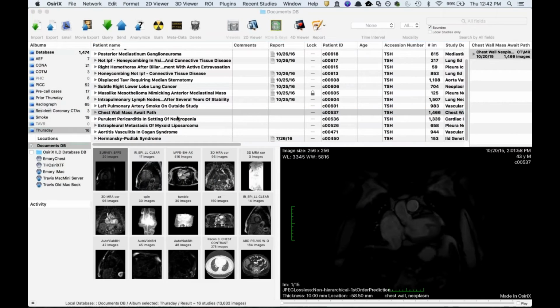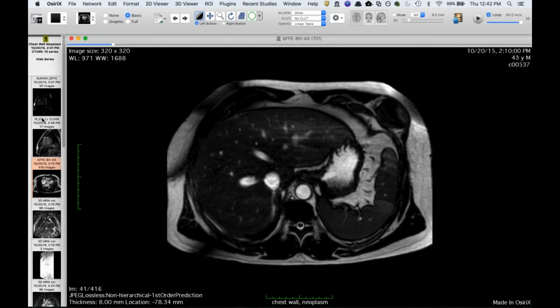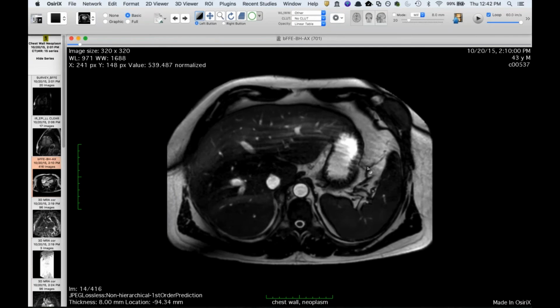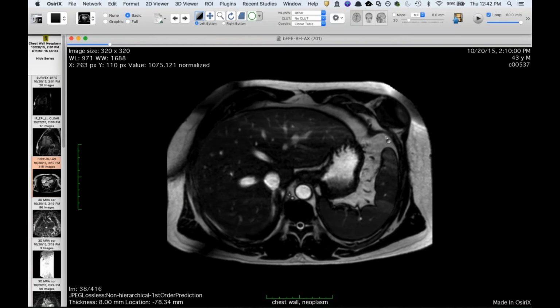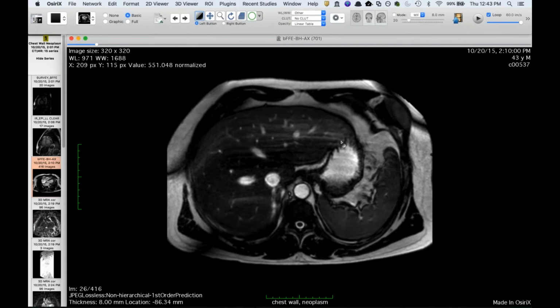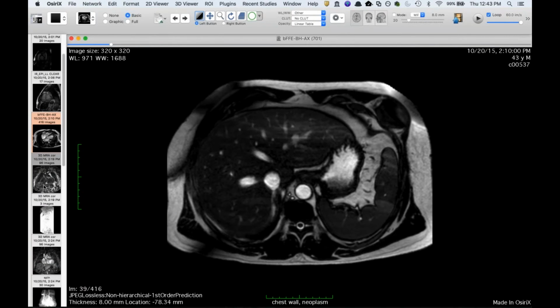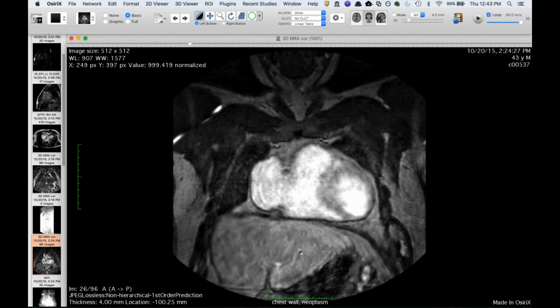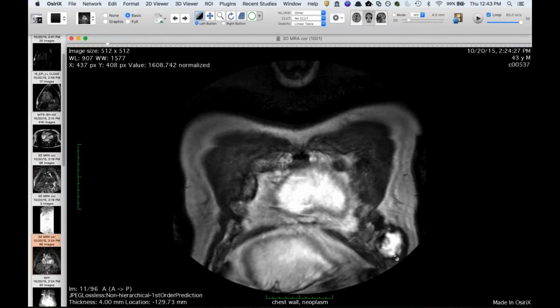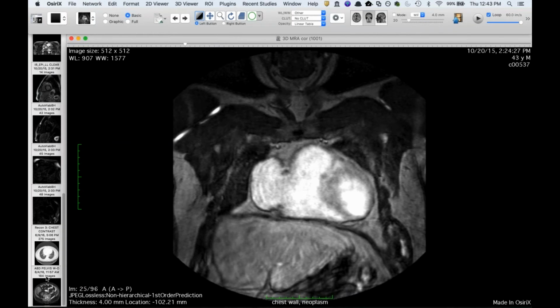This one, I was just looking up the path. I don't have the report, but I can tell you what it was. I showed this one a few weeks ago, and this was an incidental finding. This was an MRI done for left atrial mapping for AFib ablation, and there was this mass that was overlooked at the time on this study. This was back from last October, and you can see it's deep to the pectoralis muscle here, and this is pre-contrast. Post-contrast, you'll see it fairly avidly enhances. And so this was brought to our attention back in June.